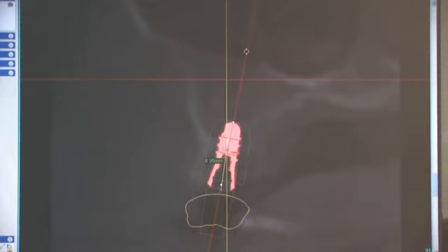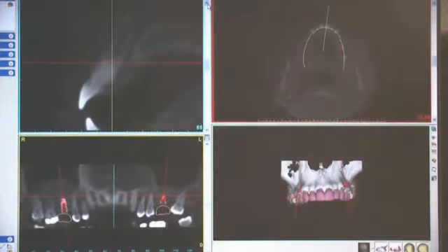So I guess the question I have for you would be: would you either stay with the 9 and do a little bit of a bump, or get a little more invasive when you have to go into a little bit longer implant? Knowing that we do have some pathology in that area, the decision was made to put a 9 millimeter implant in. What I'm trying to virtually determine is to keep the implant away from the natural teeth.